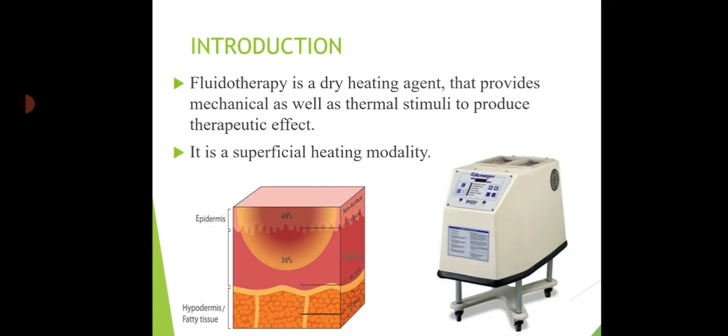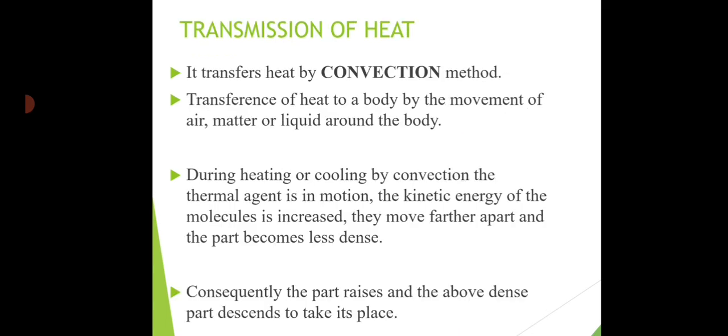Okay, so let's see the definition of fluidotherapy. Fluidotherapy is basically a dry heating agent that provides mechanical as well as thermal stimuli to produce a therapeutic effect. It is a superficial heating modality. As you can see here, this is the equipment which is used for fluidotherapy. Depending upon the area being treated, it is usually done for the upper limb and the lower limb.